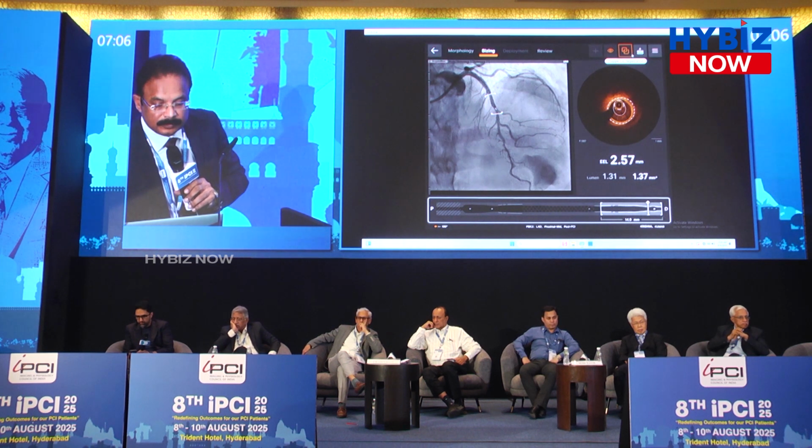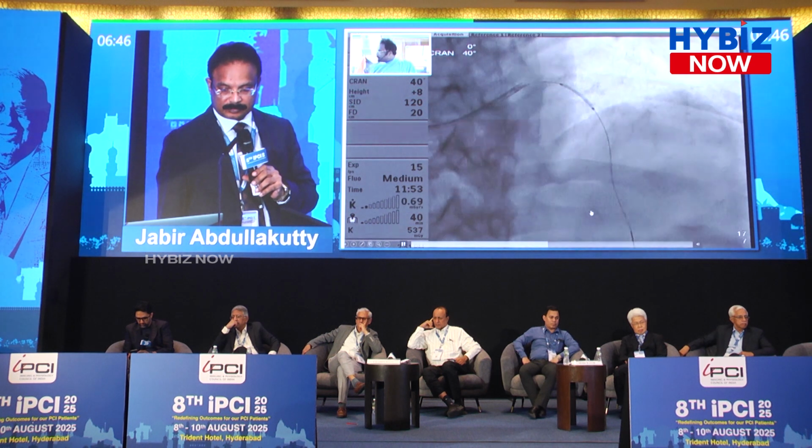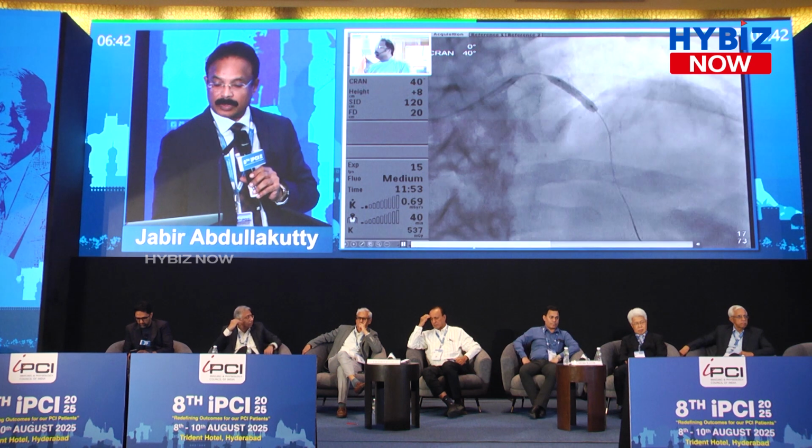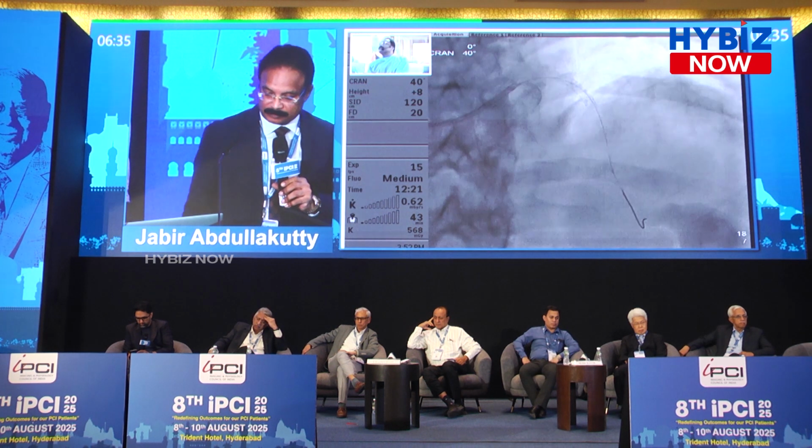Is it okay? Yes. It's moving a bit. This is 3.5 by 15. You can see angiographically the proximal part is okay, distal there is little negative.